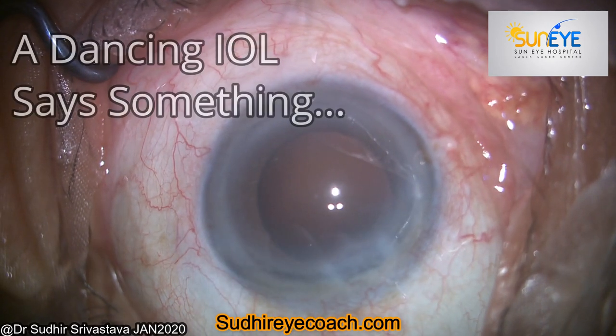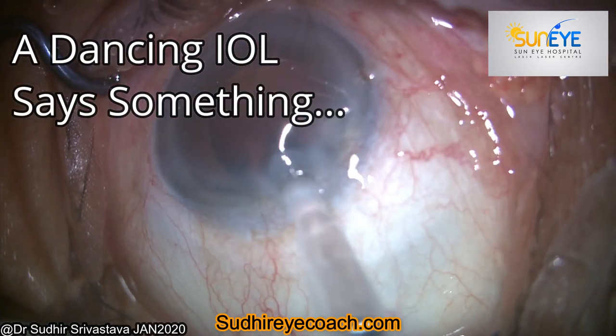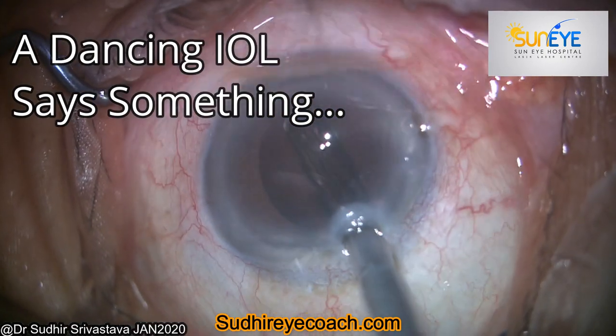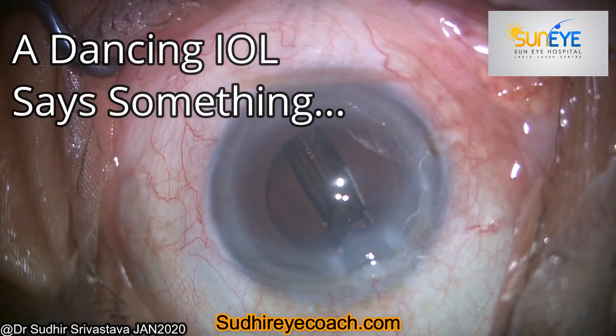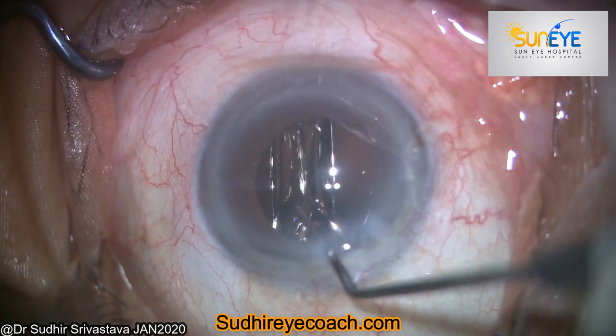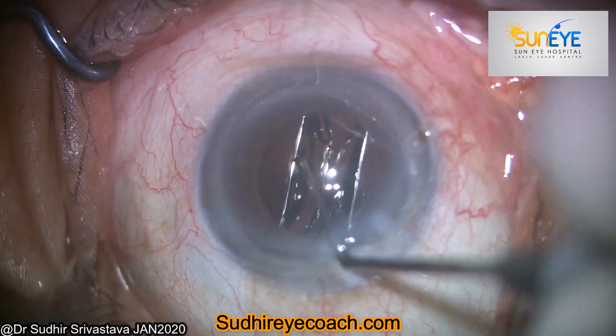Hello everyone, today I would be sharing an interesting observation which you all must have encountered or experienced in your surgical life. It is the dancing IOL, or IOL flutter, during the irrigation-aspiration at the time of OVD removal in regular phaco surgery.